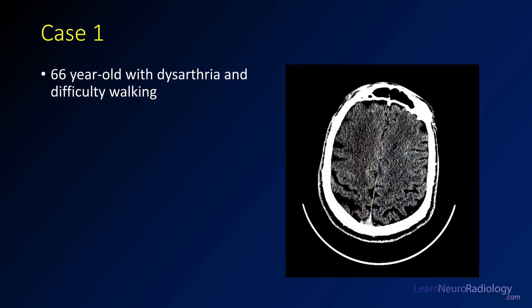So this case is a 66-year-old with dysarthria and difficulty walking. Here you see a single image from a head CT, kind of in the center of semi-ovale, so above the level of the ventricles.